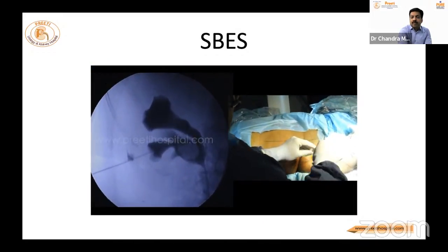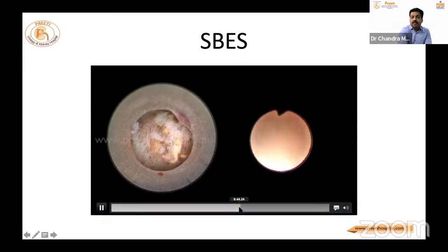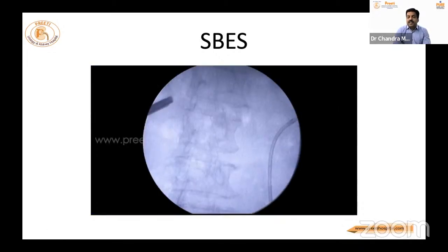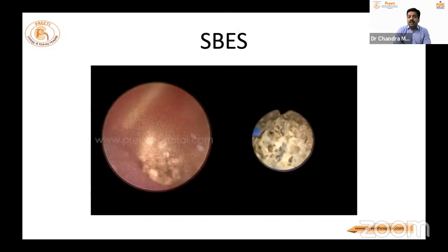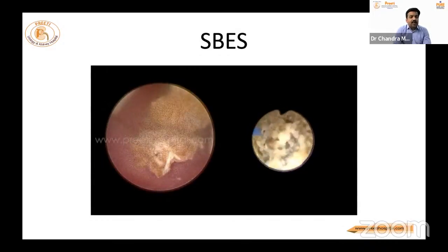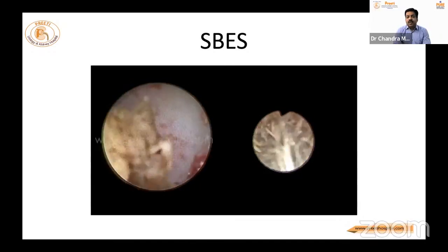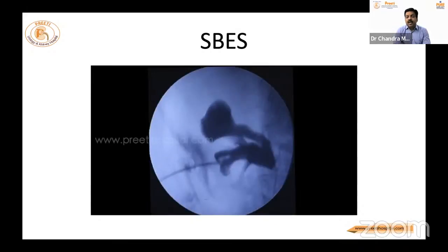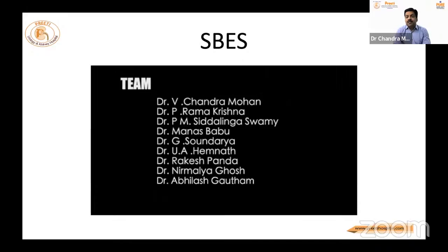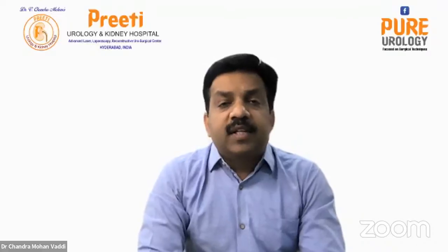Let the RIRS surgeon sleep, as Professor Sung said. And once you have punctured and are inside the system, both are operating now. The junior RIRS surgeon and the senior PCNL surgeon will be operating, one using a pneumatic lithotripter, another using the RIRS. So ultimately, the technology can be used safely, provided you have a sterile urine culture, a good drainage system, and a well-dilated ureter. If you have an ideal case, both can be done in half an hour, and that saves time, saves money, saves 2 admissions, and improves patient safety if the cardiorespiratory system is compromised. So I thank you once again for giving this 10 minutes extra.